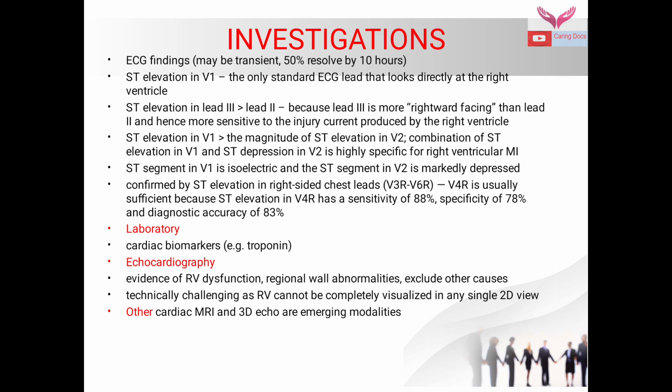ST segment in V1 is isoelectric and the ST segment in V2 is markedly depressed. It is confirmed by ST elevation in right-sided chest leads, that is V3R to V6R, and V4R is usually sufficient because ST elevation in V4R has a sensitivity of 88%, specificity of 78%, and diagnostic accuracy of 83%.